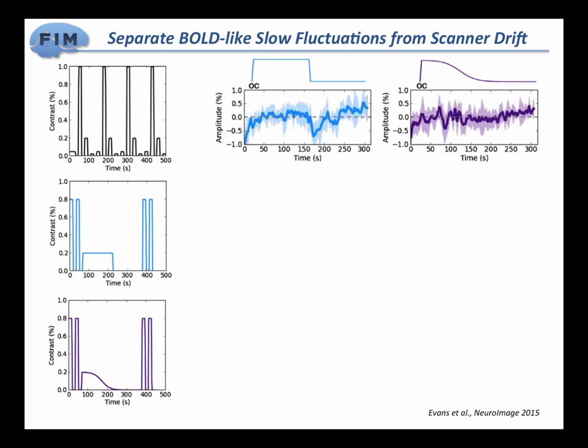So Jennifer Evans, when she was in our lab, did this experiment in which she tried to evaluate how well MEICA can help us when we have block designs, but not your normal block designs of 20 seconds on, 40 seconds off. Block designs where the duration of the stimuli lasts, in this case, over 2 minutes, one in which there is a flat on-off, and another one which is even more subtle, in which the change of interest slowly goes from that on to that off position during the 2 minutes.